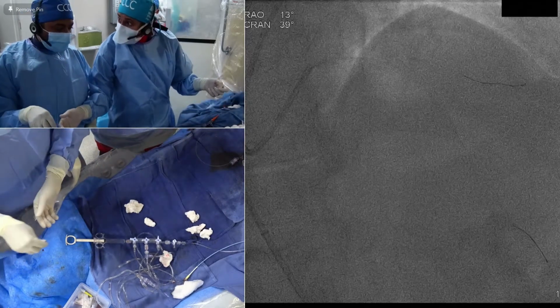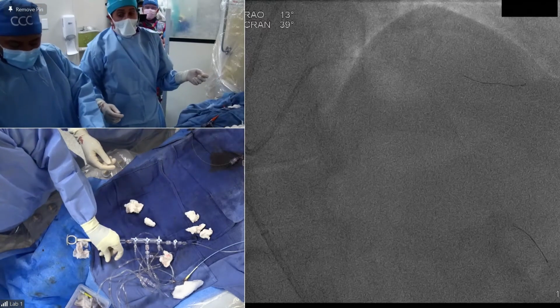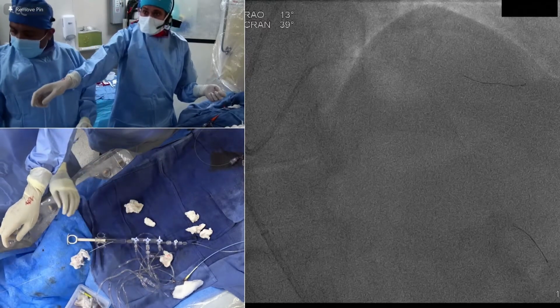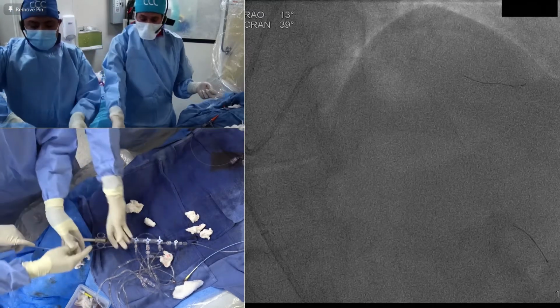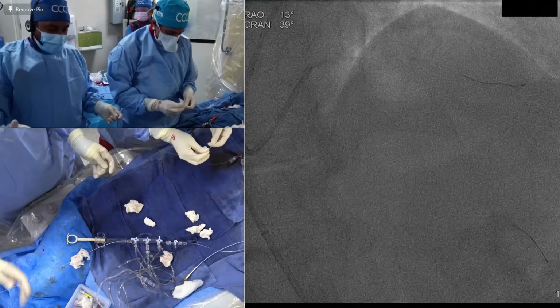2.5 is a 4. All right, we have 21 minutes to the end of this transmission. And Dr. Sharma has slowly made his way to the next room for case number 8, I presume. But we continue to stay here to see the double stent technique, exactly as the app planned and suggested.